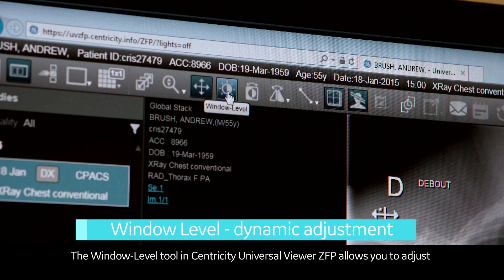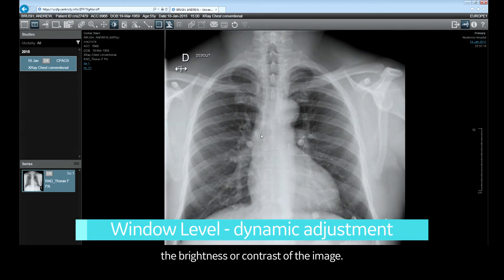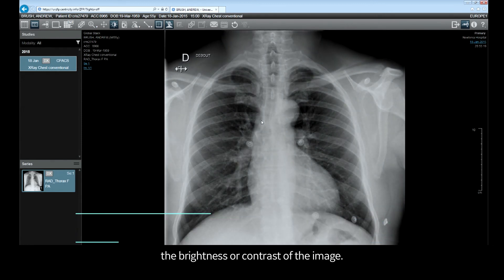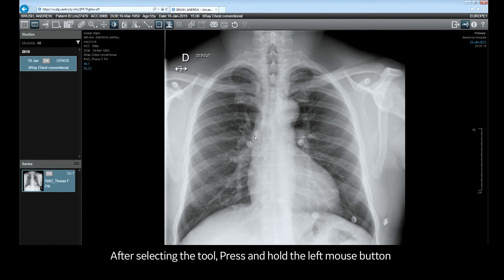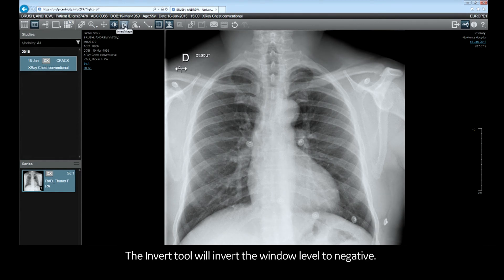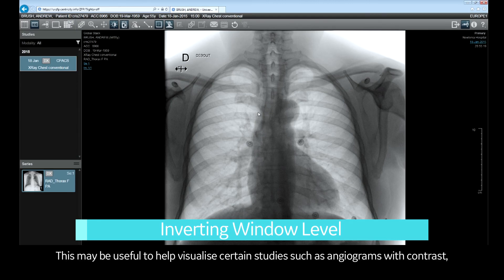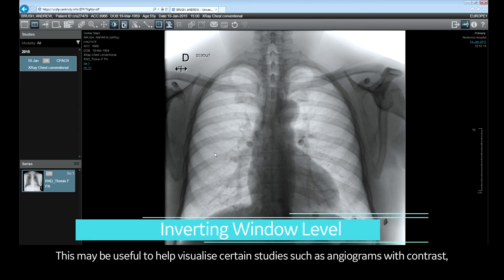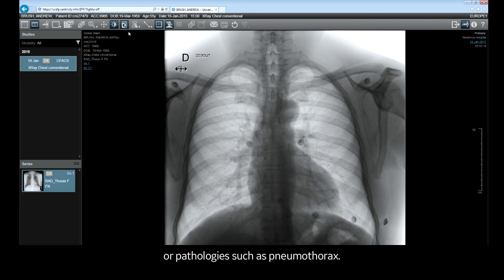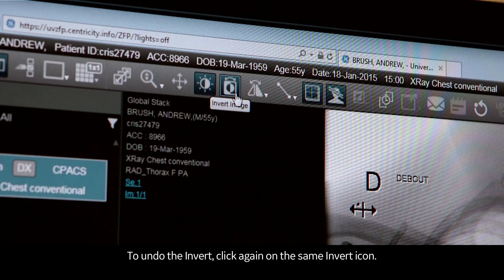The window level tool in Centricity Universal Viewer ZFP allows you to adjust the brightness or contrast of the image. After selecting the tool, press and hold the left mouse button while pushing the mouse forward or backwards or left and right. The invert tool will invert the window level to negative. This may be useful to help visualize certain studies such as angiograms with contrast or pathologies such as pneumothorax. To undo the invert, click again on the same invert icon.